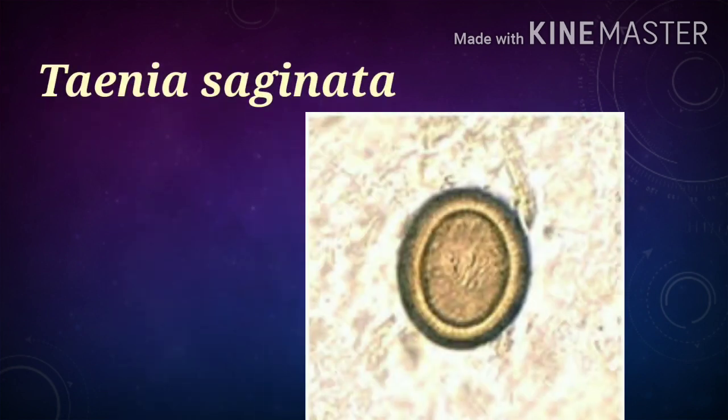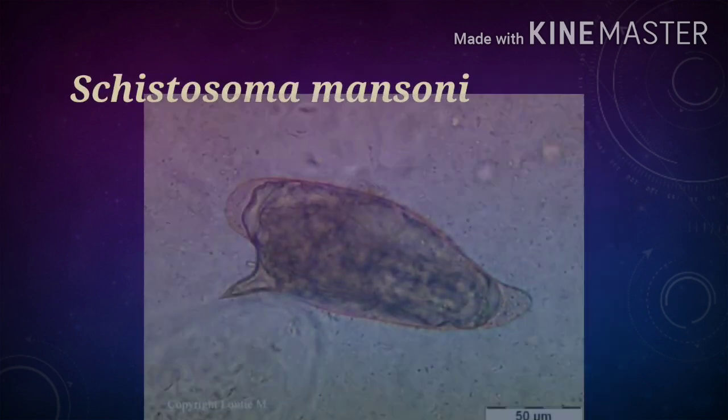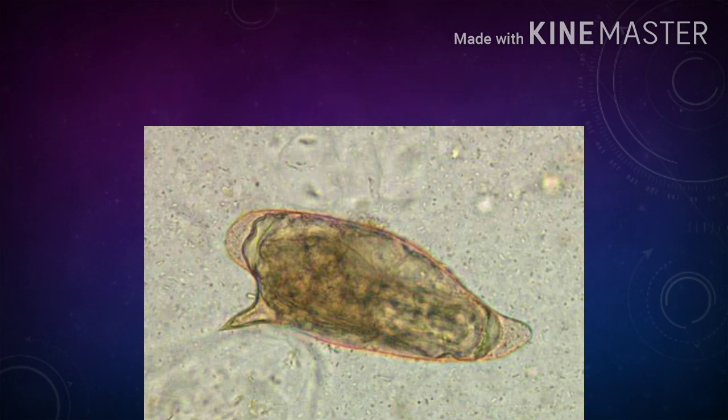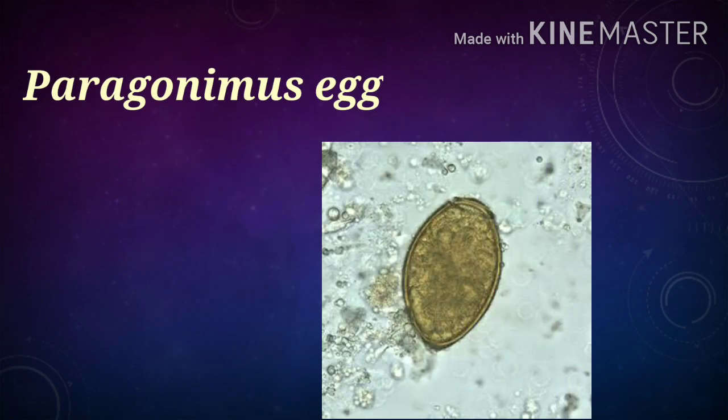Next we watch Taenia saginata. The microscopic view of a single Taenia saginata is shown at 40X objective in the microscopic field. The next picture shows Schistosoma mansoni, and then the picture shows Schistosoma mansoni egg in the microscopic field.